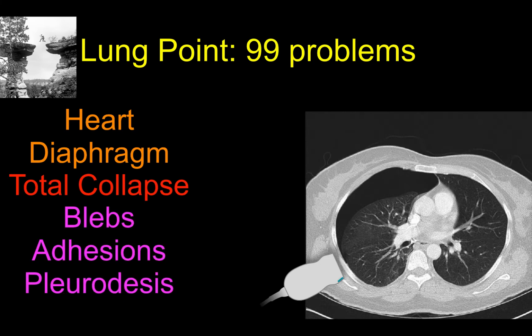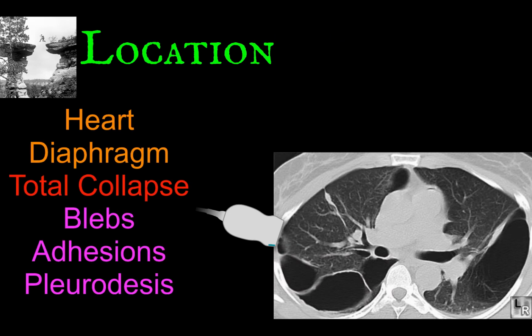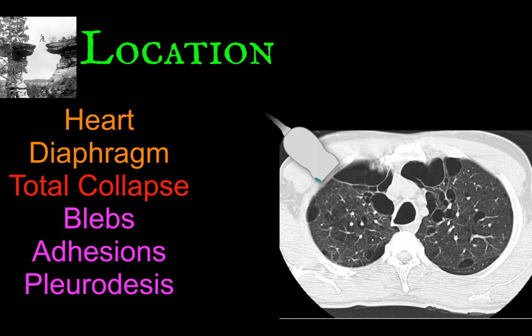How do you get around these? First, make sure that the lung point makes sense and that the lung point is actually dependent. Posterior blebs might look like a lung point, but it will look backwards. The sliding will be more anterior, and the dependent portion will be where the air is. Now, what about more pesky anterior blebs? If you're less worried about the spine, you can certainly sit the patient upright to see if the pneumo, and consequently the lung point, will move to a more antidependent region, which a stuck-on bleb or pleurodesis adhesion will not.